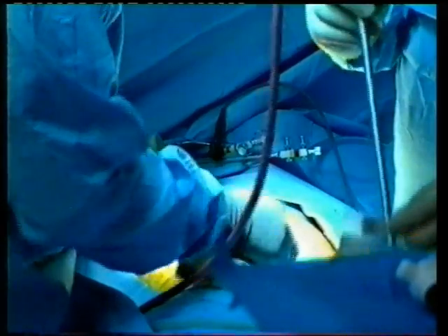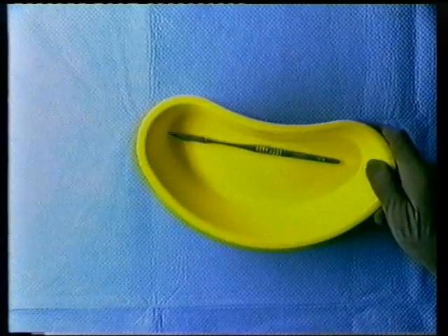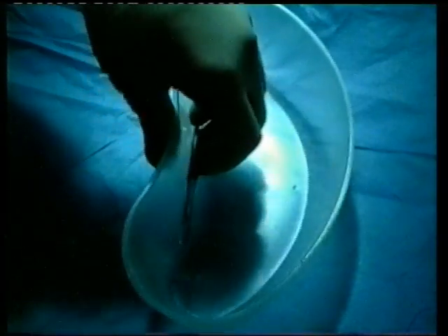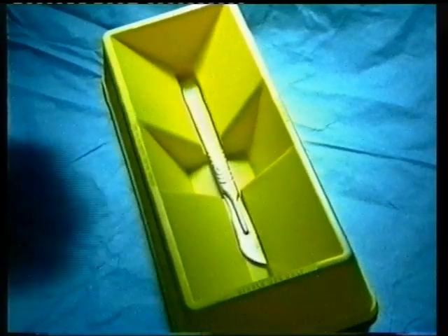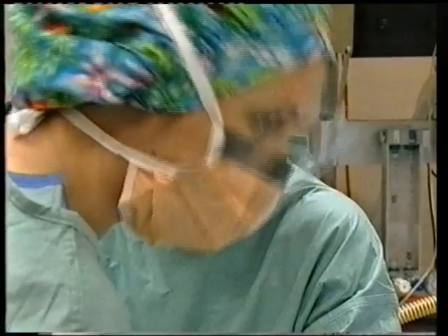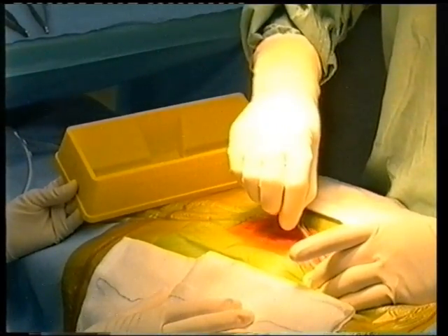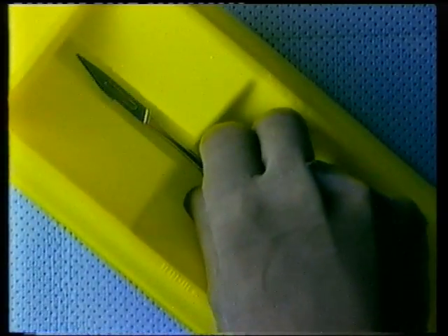See for yourself how safe and efficient sharps transfer can be using the new ScrubSafe device. The problem with kidney dishes and flat trays is that they offer no protection from the sharps that they are transferring. Their flat bases also make it hard to grip instruments safely, particularly scalpel handles. ScrubSafe features a specially shaped bottom recess that houses the sharp portion of the instrument while still allowing finger access for the user, giving the gloved hand maximum protection.